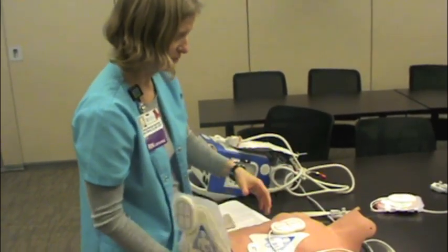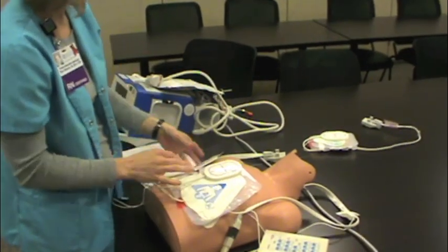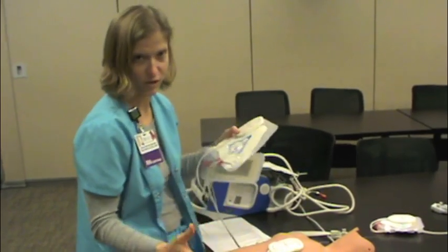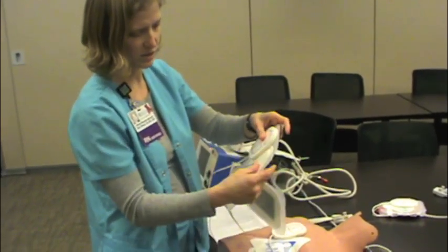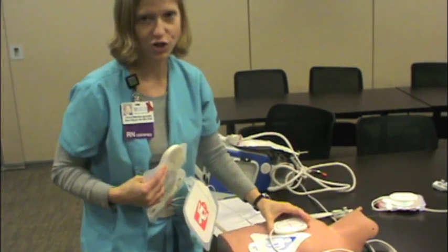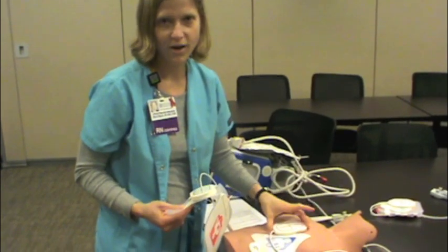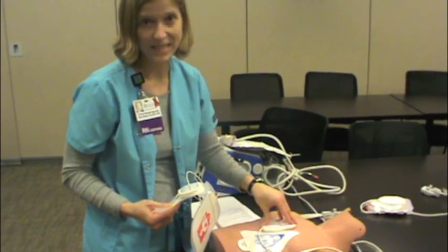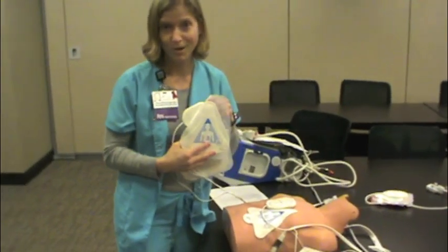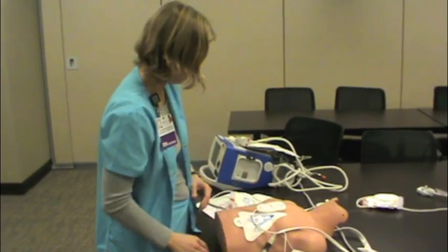On a normal-sized person this all goes on in one piece — very easy to stick on. If you have a large person or a woman with a large breast, it's okay to tear it apart. It's very important that this CPR sensor goes on the sternum where you'll be doing your chest compressions — right on the lower half of the sternum. Then this patch is very important to go over the heart, so place it according to the picture.